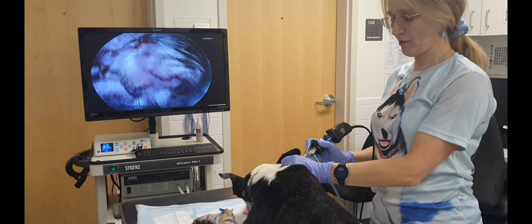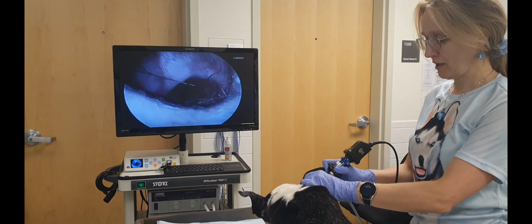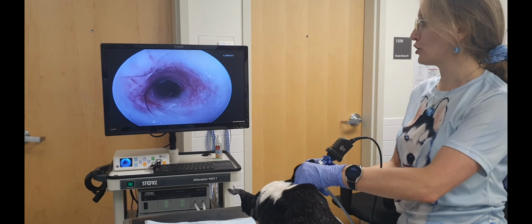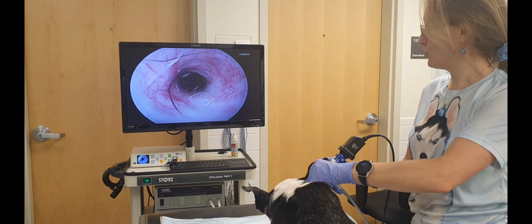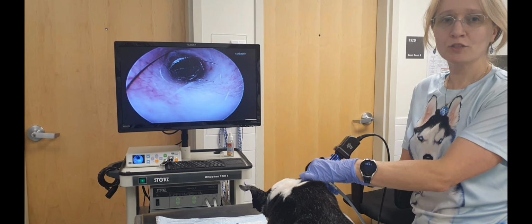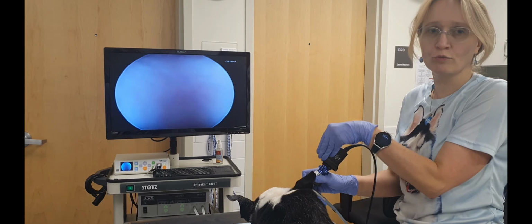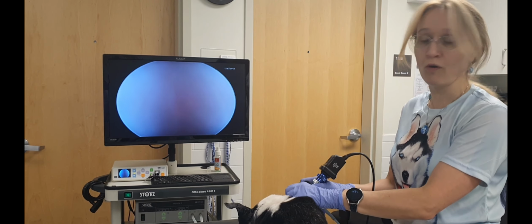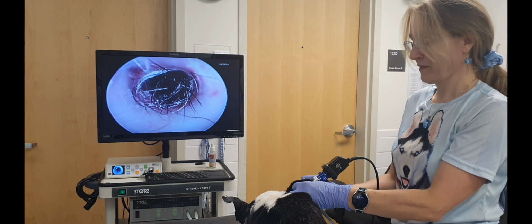The negative side of that positioning is that you need to use both hands, one for the videootoscope and another one for holding the pinna, because you need to constantly pull the pinna up, otherwise you cannot make the ear canal straight enough. So either somebody is going to help you with the pinna or somebody is going to help you with the instrument, because you need to deal with the tools inside of the canal, but you don't have enough hands for that. That's the negative side of that position.